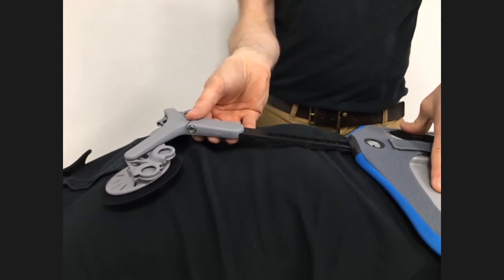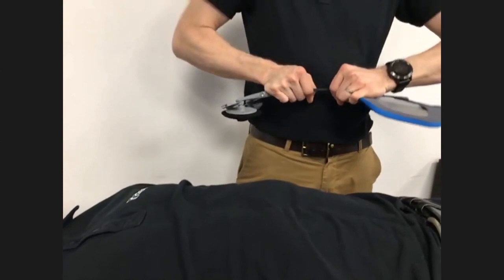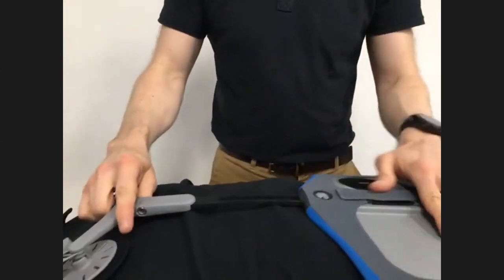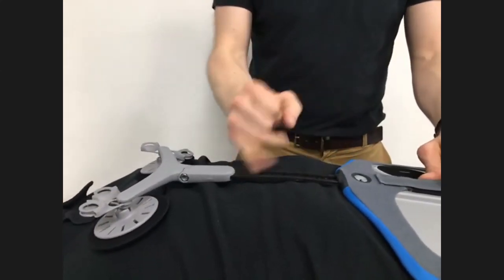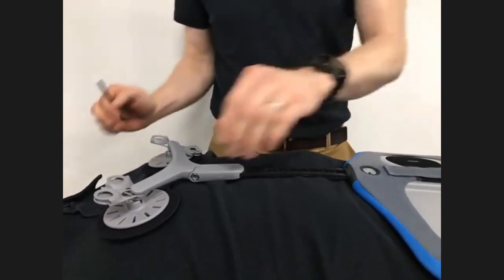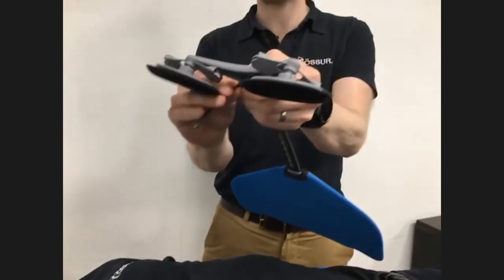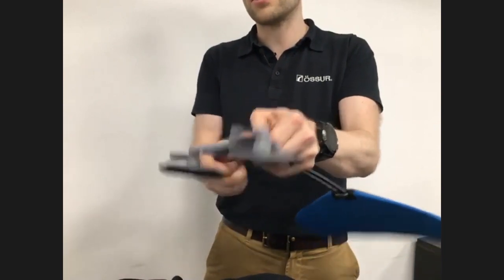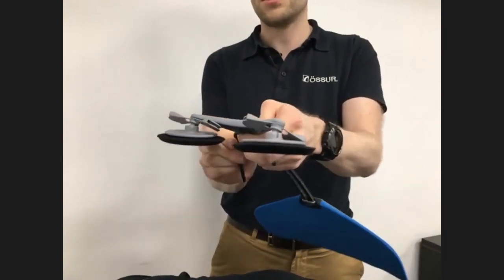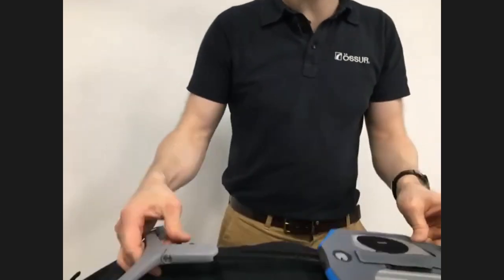To answer the question for Javan, yes, you can contour this. If needed, we can adjust this accordingly in order to get a good contour along here. So you may want to gently make that adjustment. And what's important is when you fasten this, we're applying pressure on here. It means the axilla pads are making contact and applying control before we start. So I'm just going to tighten this up either side, bring it into position and slide that there.